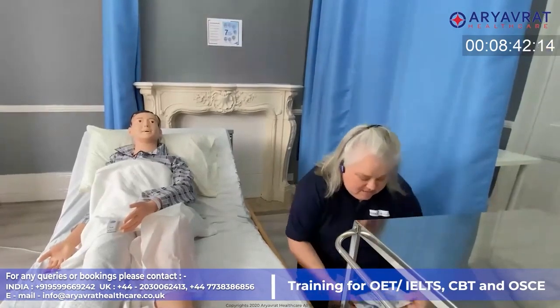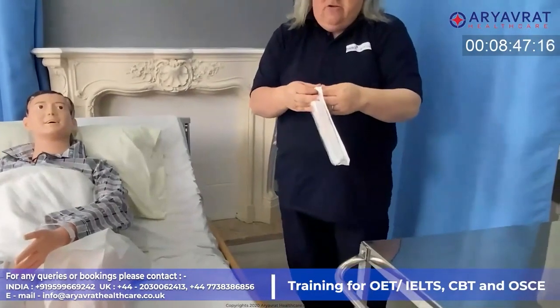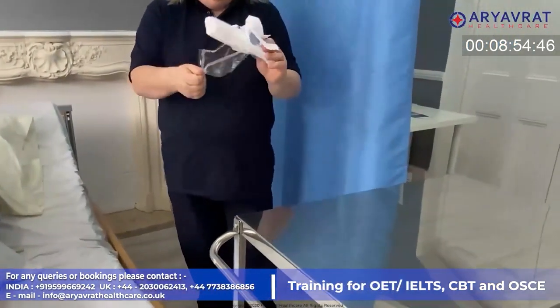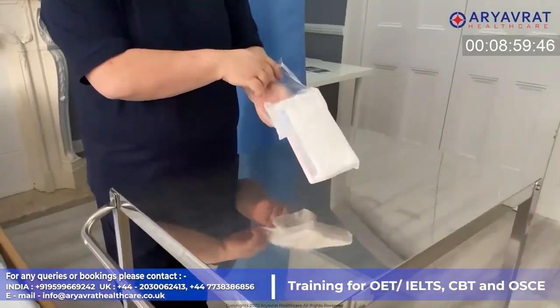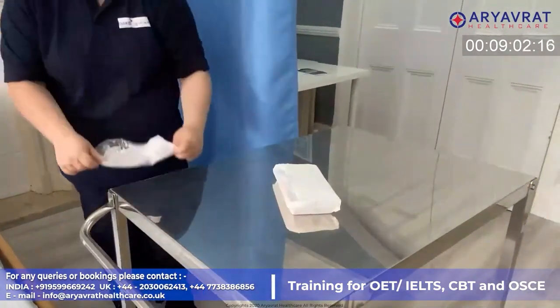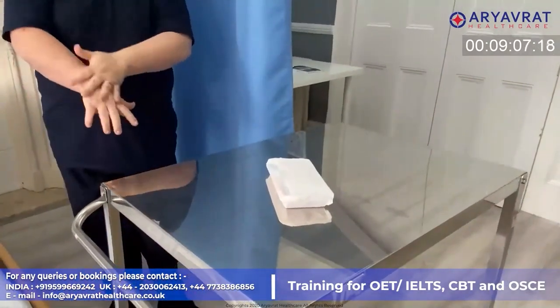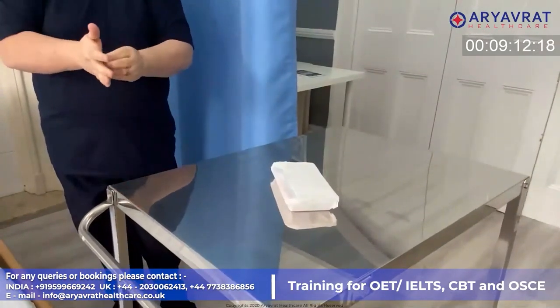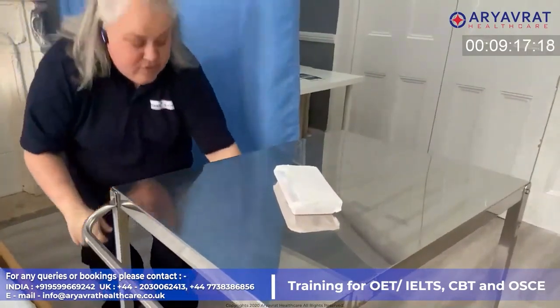So I am going to open my dressing pack away from my trolley. And I'm going to tip it out onto my sterile surface, making sure the outer packaging doesn't touch. And do my hand hygiene once more. And before I proceed any further, I will put my clean apron on.